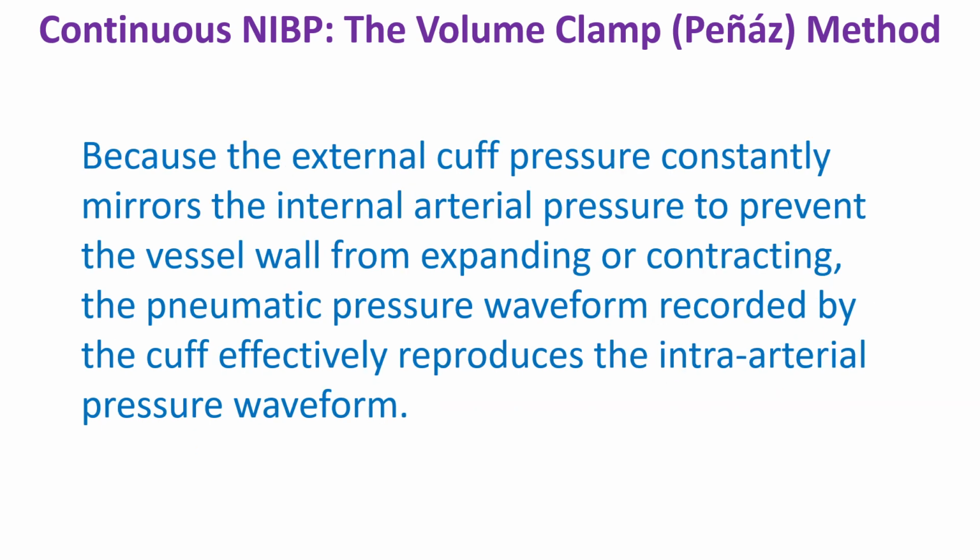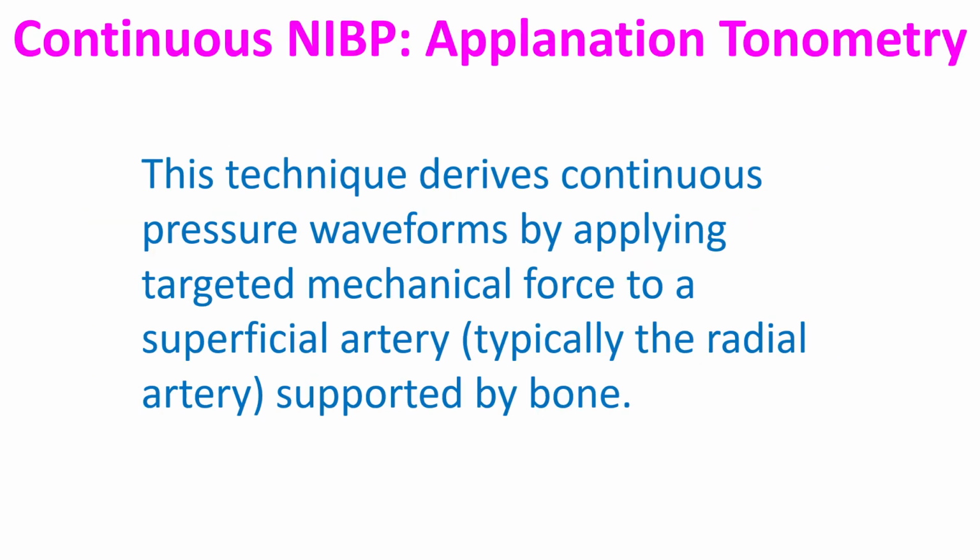Because the external cuff pressure constantly mirrors the internal arterial pressure to prevent the vessel wall from expanding or contracting, the pneumatic pressure waveform recorded by the cuff effectively reproduces the intra-arterial pressure waveform. Continuous NIBP by applanation tonometry.